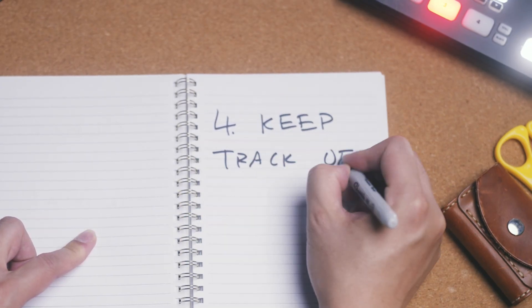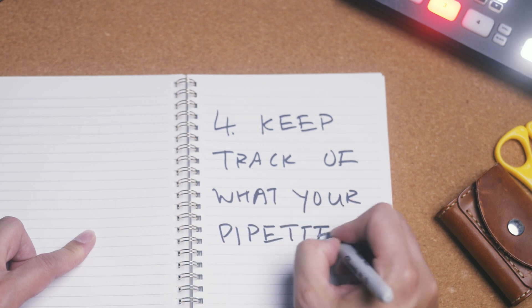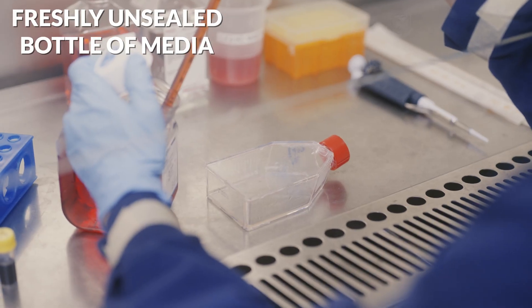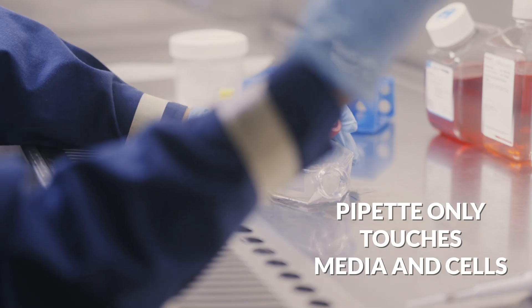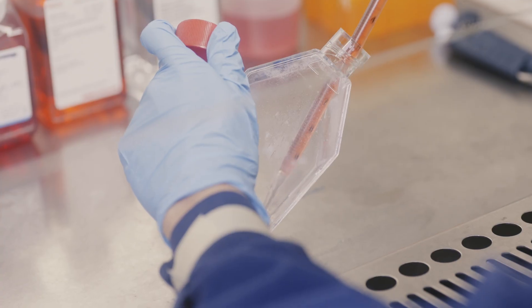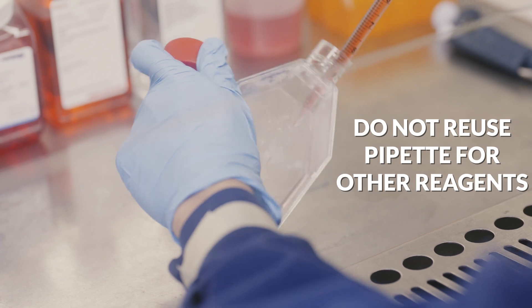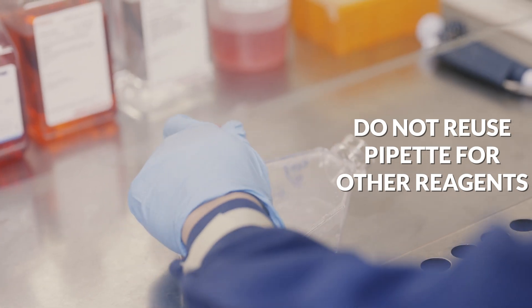Fourth, you need to know exactly how many things an item has touched before and after it comes into contact with your cells. You want single-use pre-sterilized pipettes to draw up liquid from a freshly unsealed bottle of media or buffer and transfer this to your cells without touching anything else. Conversely, anything that touches your cells has potentially been exposed to contaminants, so you need to very carefully control what touches what inside the hood.